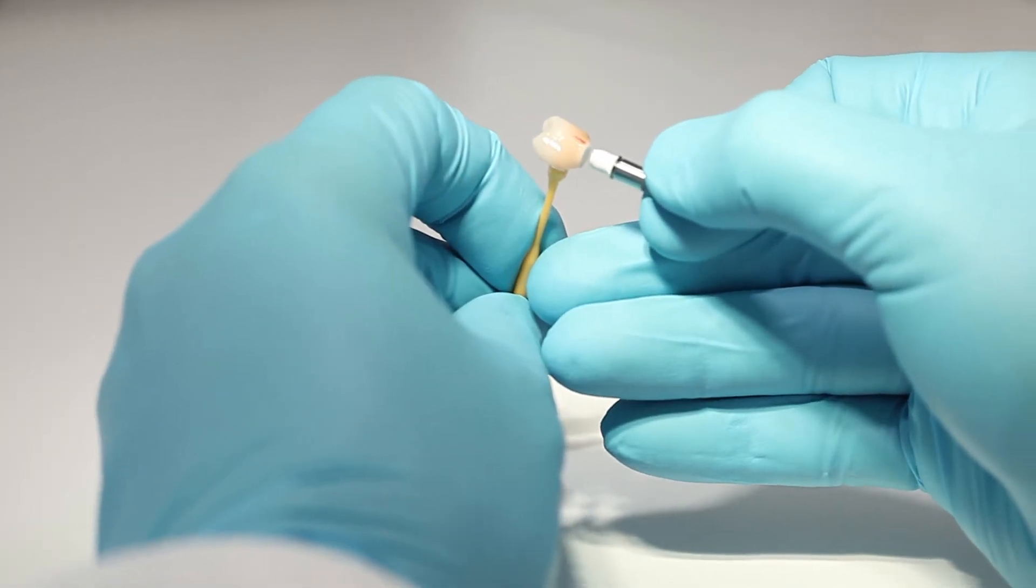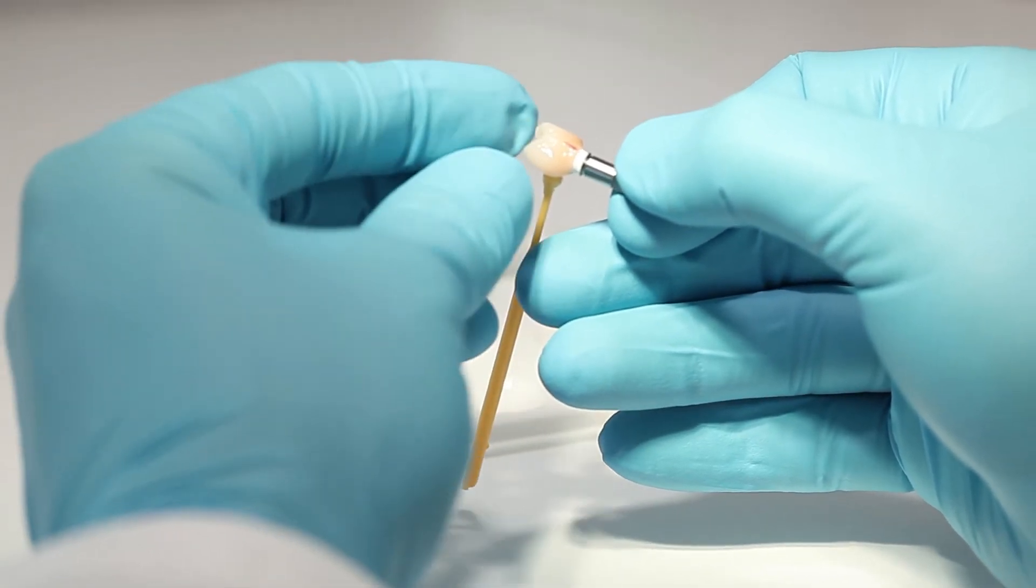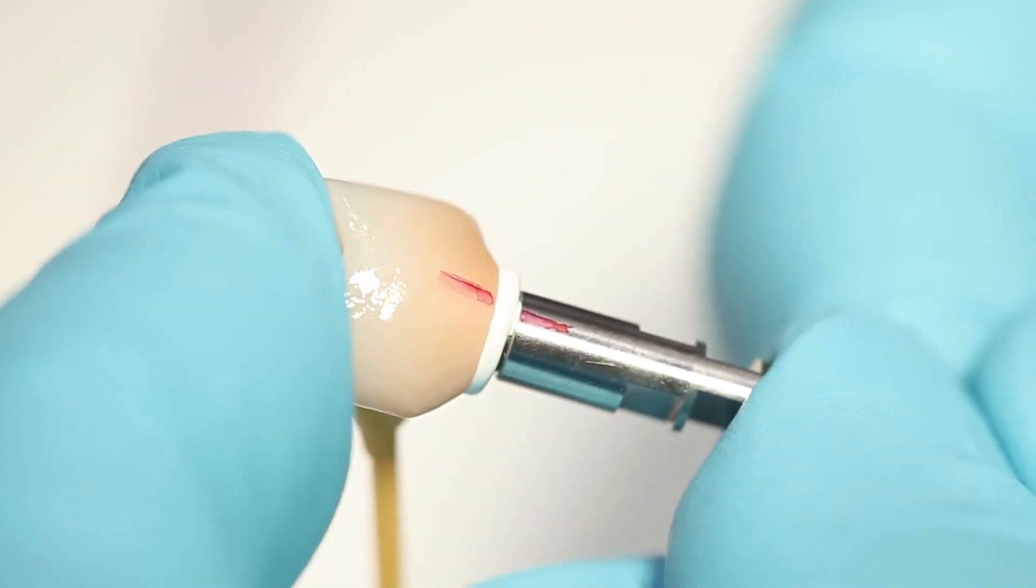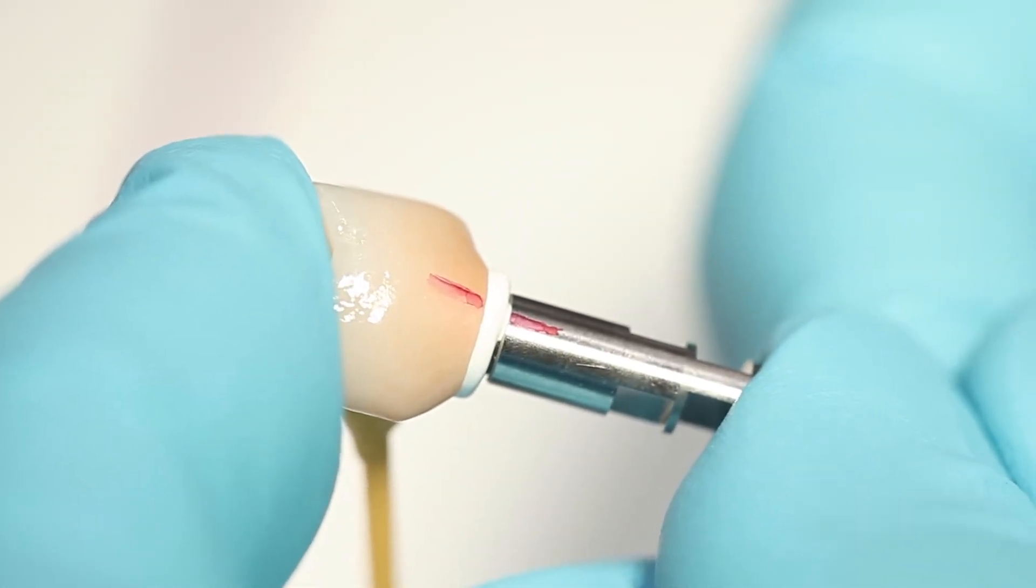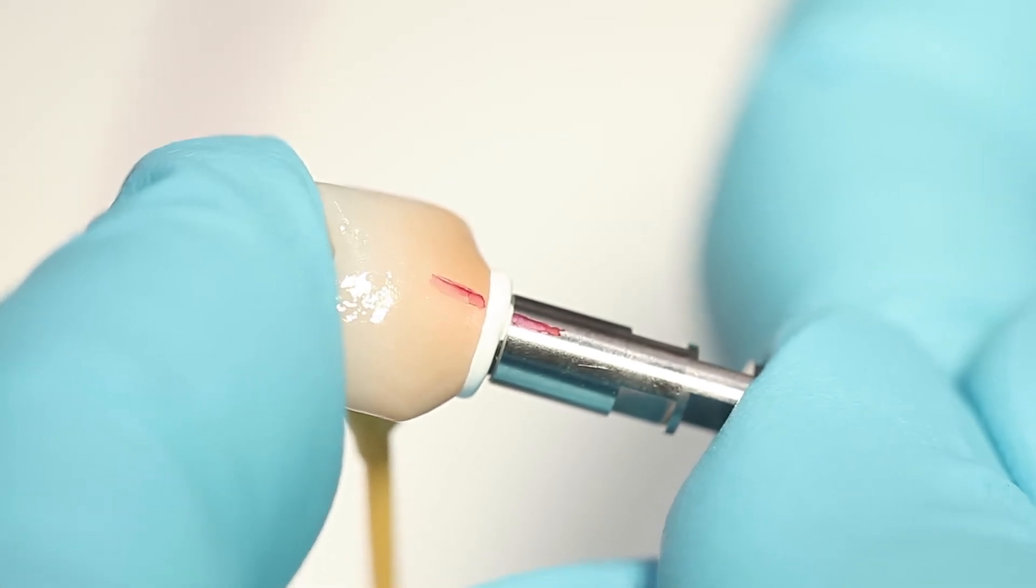Next, place the ceramic structure over the tie base in such a way that the position markings are aligned. Verify the correct final position at the transition between the tie base and ceramic structure. Then press the parts firmly together for 5 seconds.